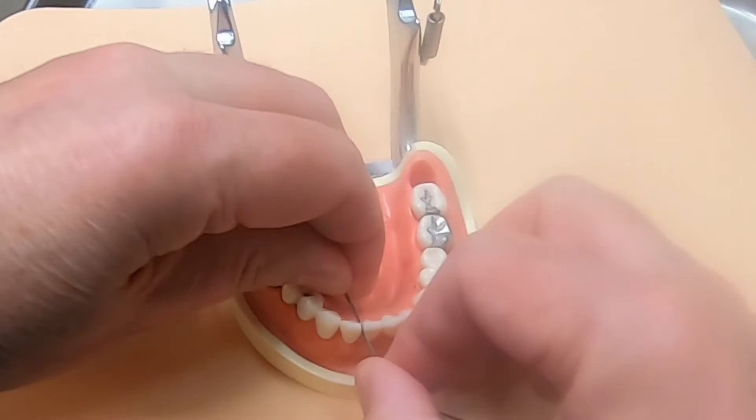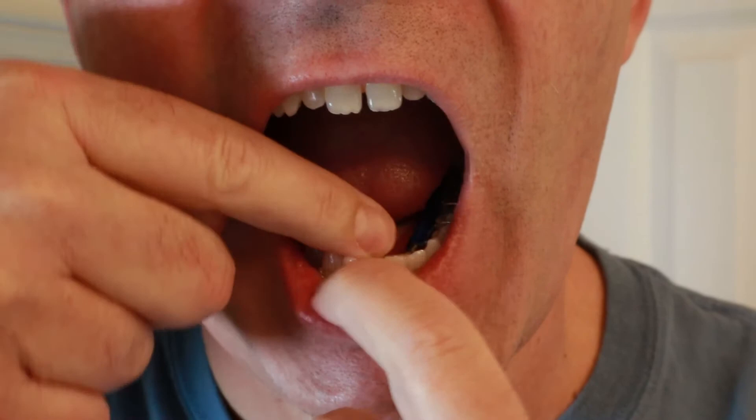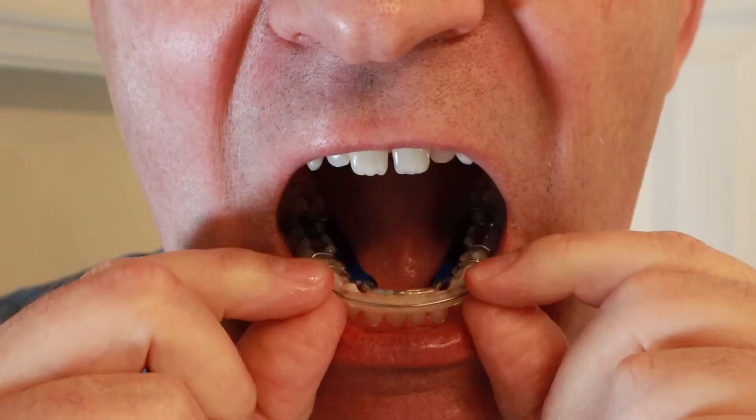Once I had trimmed my teeth I started wearing the aligner. I tried to wear it as much as possible — I only removed it to eat, brush my teeth, and when I had to speak with people. It caused me to talk funny, so I would remove it before talking to people either in person or on the phone. I wore it all night long as well.